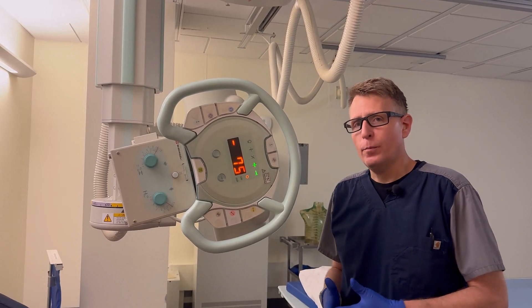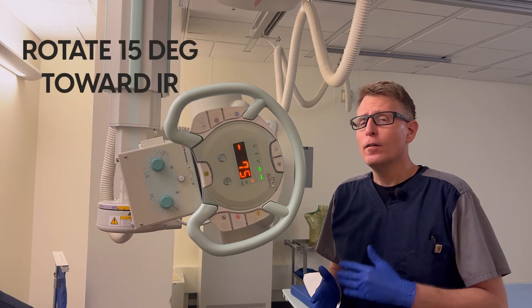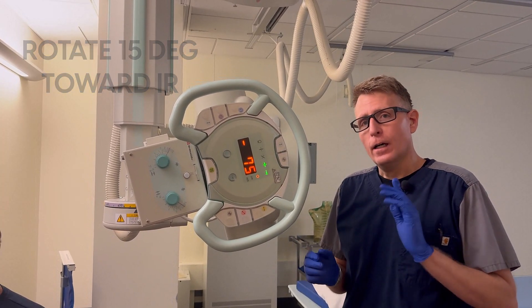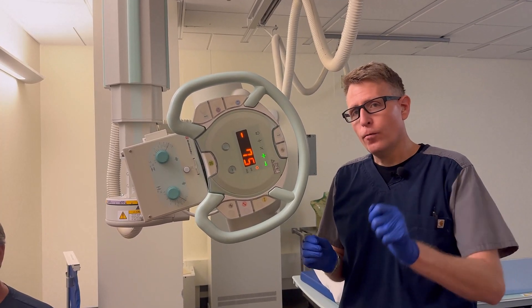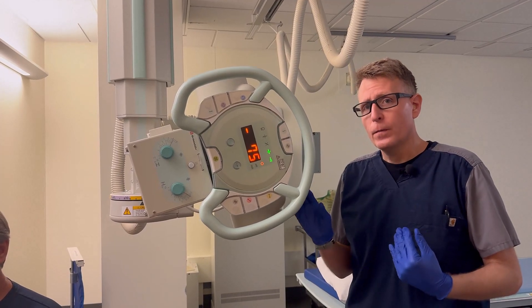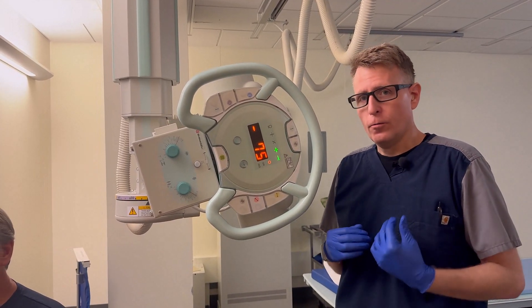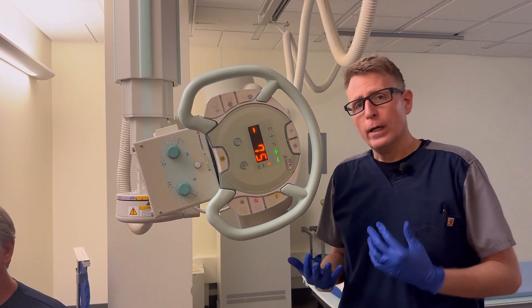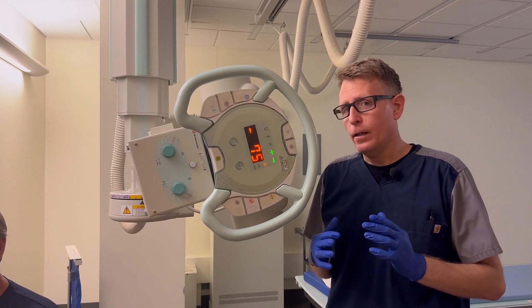We're also going to rotate the patient toward the bucky — rotating the head 15 degrees. That's going to shift the upside TMJ forward in addition to being projected down by the tube angle. So that's also going to shift our central ray entrance point as well, instead of the Schuller method where you center right on the TMJ, because we're turning the head.